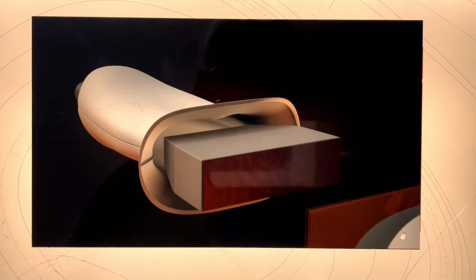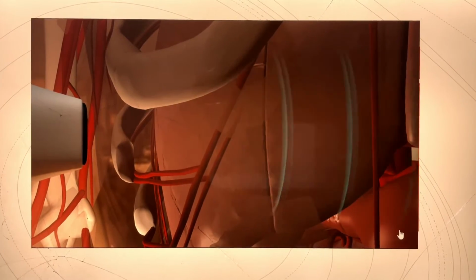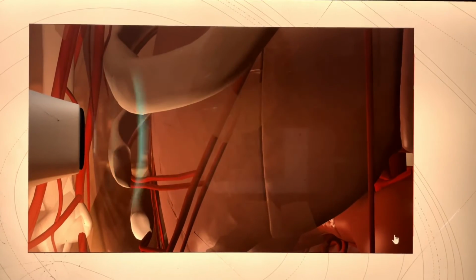The heart of most ultrasound systems is a device called a transducer, which uses an array of piezoelectric crystals. A piezoelectric crystal vibrates when an electric signal is applied, producing high-frequency sound pressure waves, which we call ultrasound. More importantly, this type of crystal can also work in reverse. It can produce electrical signals when it detects high-frequency sound pressure waves. When a transducer directs ultrasound waves into the body, they pass right through the skin and into the internal anatomy. As the waves encounter tissues with different characteristics and densities, they produce echoes that reflect back to the piezoelectric crystal.